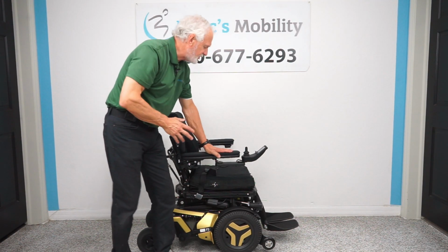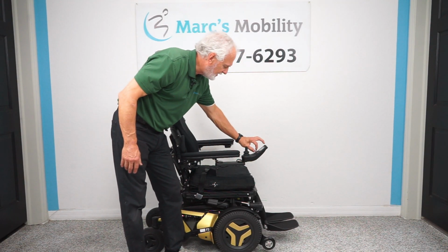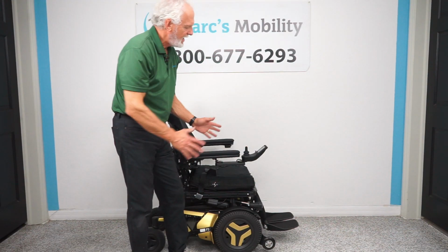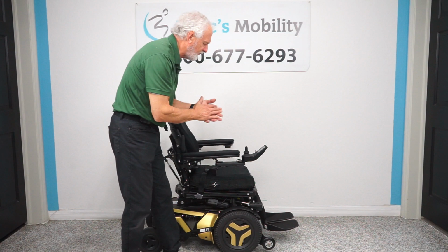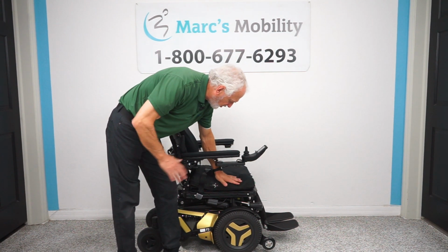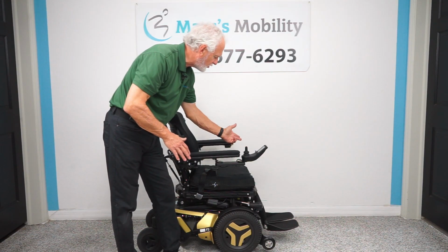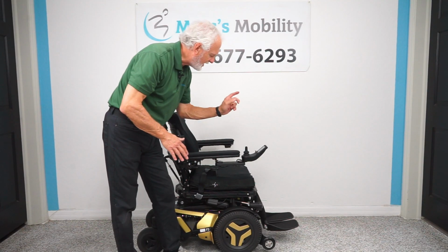So all the functions on this chair need to be worked through the joystick. What you do is go to your joystick, and the button that you turn the power on, you're going to keep going forward with it until you see a picture of your seat in the screen. As soon as you see a picture of the seat in the screen, whatever portion of the seat is yellow, that's what's going to be working. So we want just the bottom cushion to be yellow because we're going to start showing you the seat lift to start with, okay? If it's not yellow, just move the joystick side to side and change the colors until you have the bottom cushion only yellow. So I have the bottom cushion yellow.